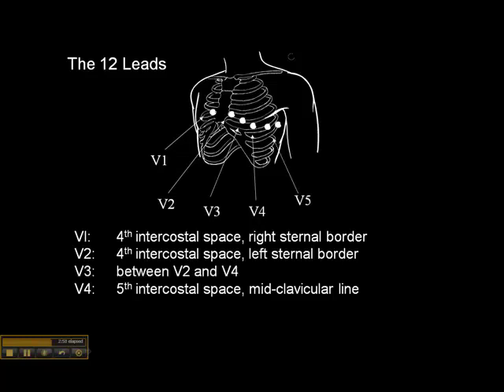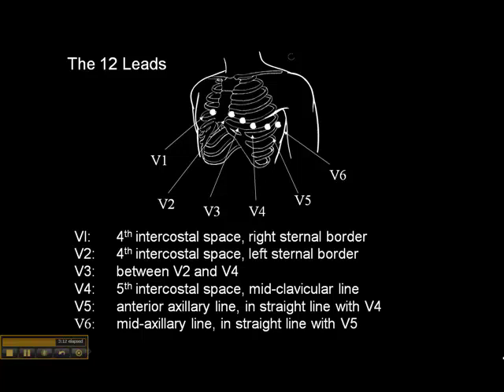V5 and V6 go in a straight line from V4. V5 goes at the anterior axillary line, which is the armpit fold, in a straight line with V4. And V6 goes at the mid-axillary line, which is midway in the side of the chest, in a straight line with V5. Those are the six precordial leads.